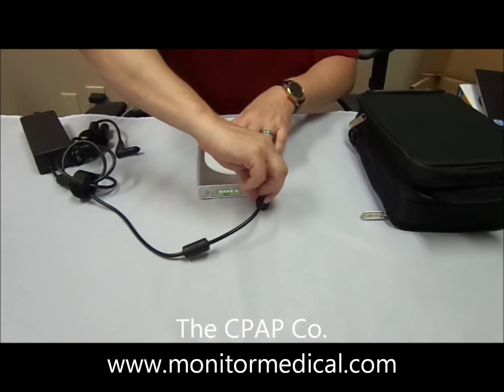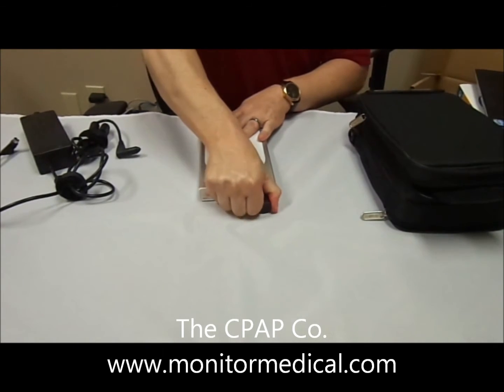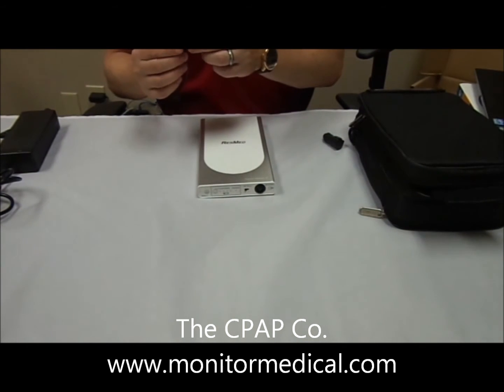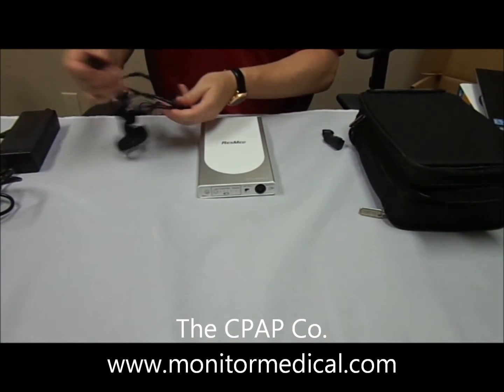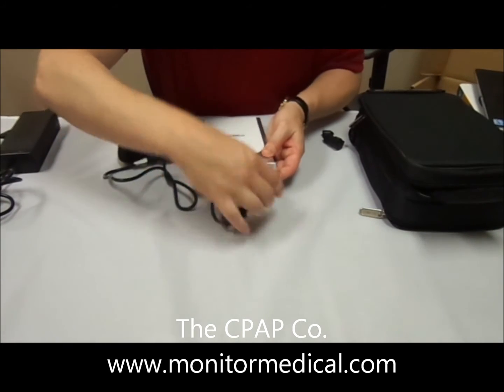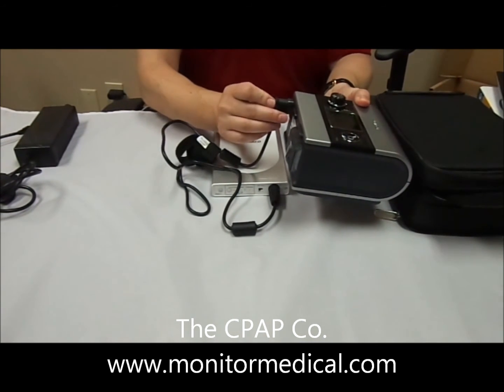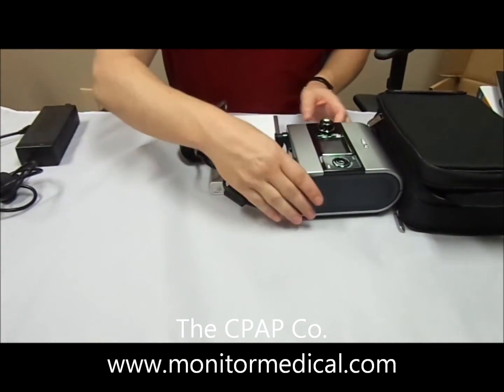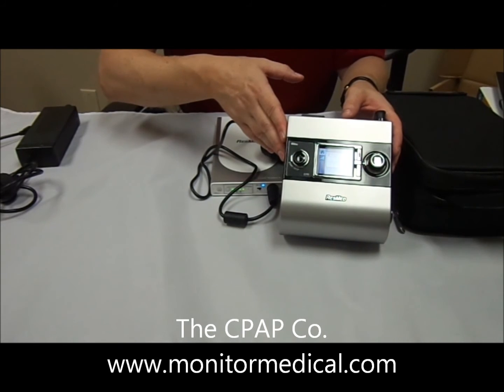Now let's transition into plugging this into the S9 unit. We're going to take off the ResMed power cord and PSU adapter for charging, and take our DC cable. There's a little protector here — you want to unplug that. Connect the DC cable into your ResMed Power Station 2. Again, the pins will line up, no need to force it — just glides right in. Take the other side, connect it to your S9 unit just like your power cord, and then switch the unit on. As you can see, it powers up your ResMed S9 CPAP.